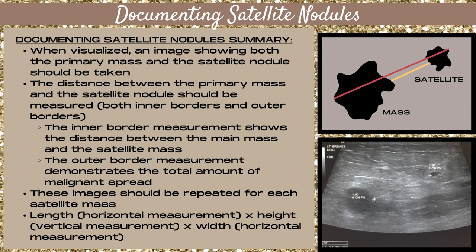When a satellite mass is visualized, an image showing both the primary mass and the satellite nodule should be taken, as long as you can get them both on the same screen together. Often changing the field of view to a sector orientation will help you with this. You want to measure the distance between the primary mass and the satellite nodule — both the inner borders and the outer borders.